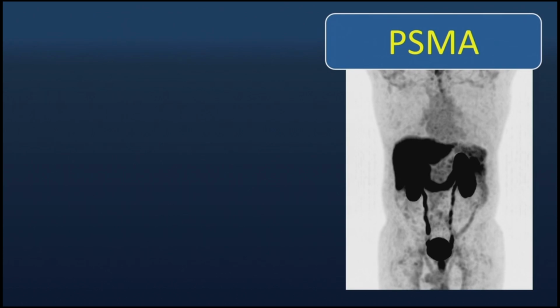So here's a PSMA PET. No eye test here, this was negative. This person had 2 sequential negative scans. PSA was continuously going up. We look back at their staging PSMA PET, and it showed very little uptake.